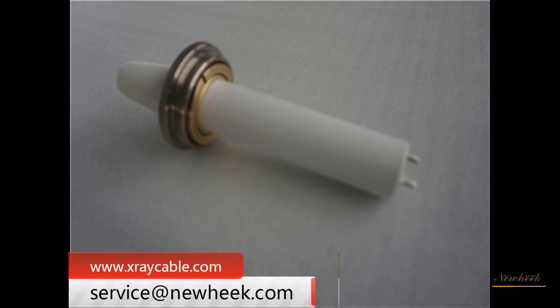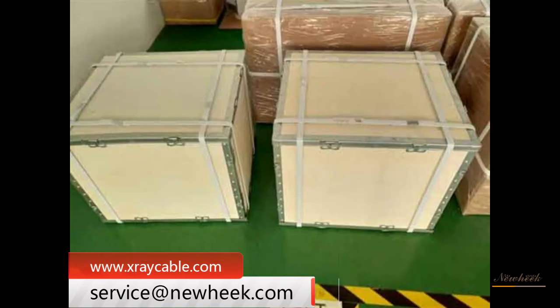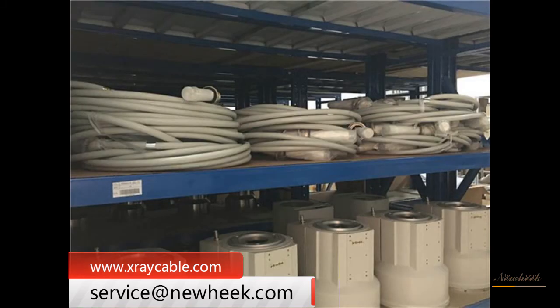The new HEC high-voltage cable is divided into several types, including 75 kilovolts and 90 kilovolts. The length can be customized according to the customer's needs. New HEC high-voltage cable can meet your different purchasing needs.